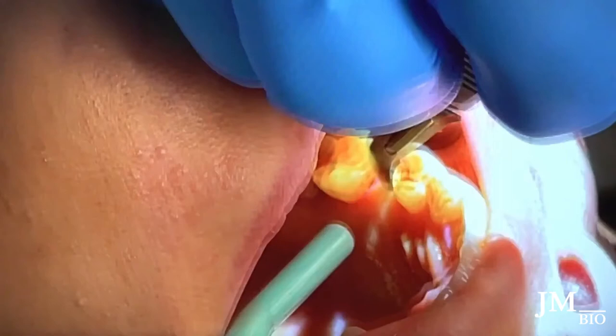Even though she has plenty of keratinized tissue, I'm still directing my incision slightly lingual to the crest — just in case I need to gain any keratinized tissue on the buccal. It's very minor, but she's got plenty of good tissue.